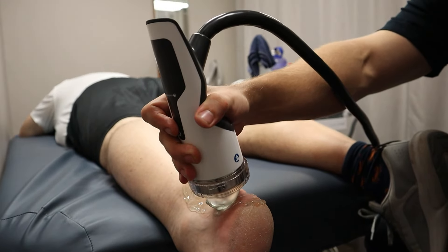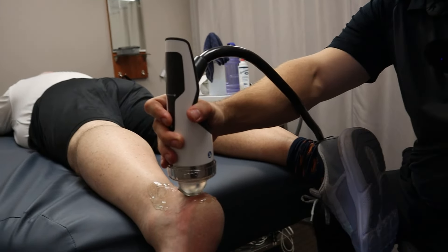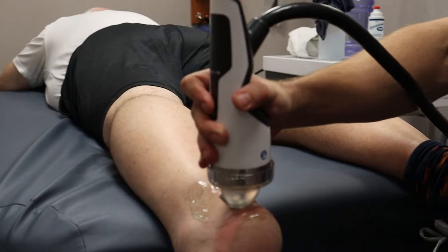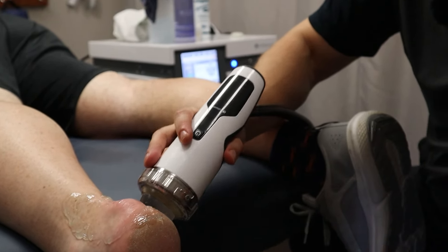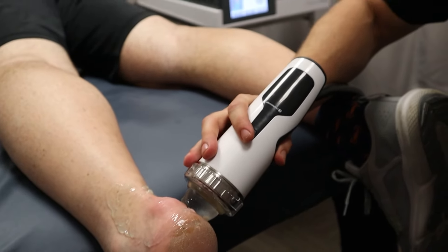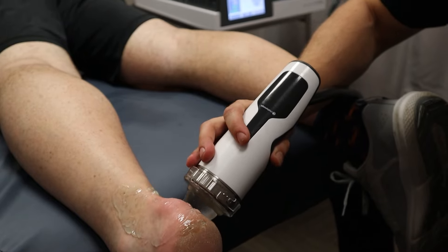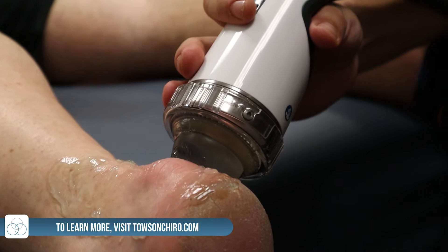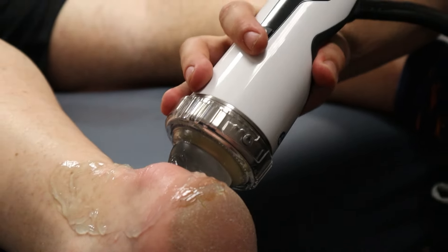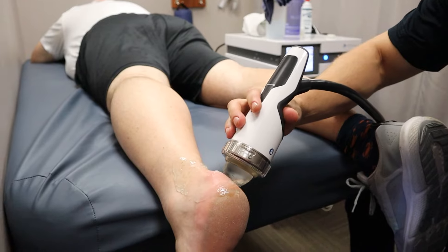This video is really showcasing the variety of tendinopathies that we can treat here in the office with the Focus Shockwave. This is a good example because it's an area that would be a little too sensitive if we used the radial pulse shockwave, especially right here on the Achilles heel. As you can tell from the video, it sounds much different — it's not a percussive sound wave. With the Focus Shockwave we're using a tank of water to actually create that shockwave, as opposed to the other unit that uses basically a magnetic bullet contacting a titanium or steel plate.